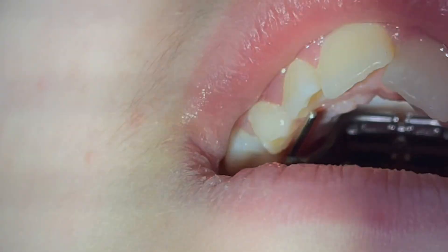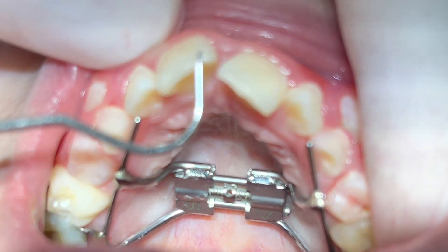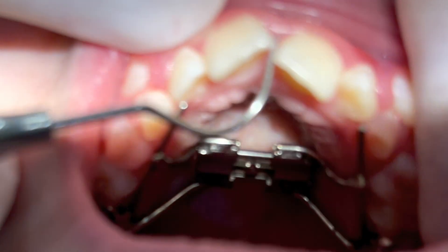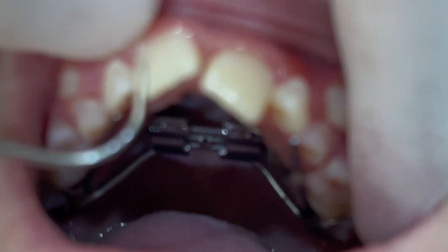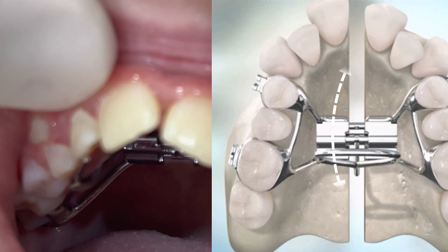After 10 days we will notice the gap in the middle. This gap will close spontaneously and partially, and when we place braces it will close completely.